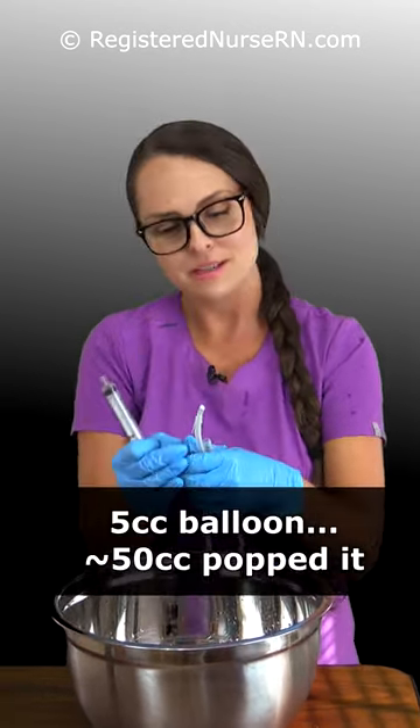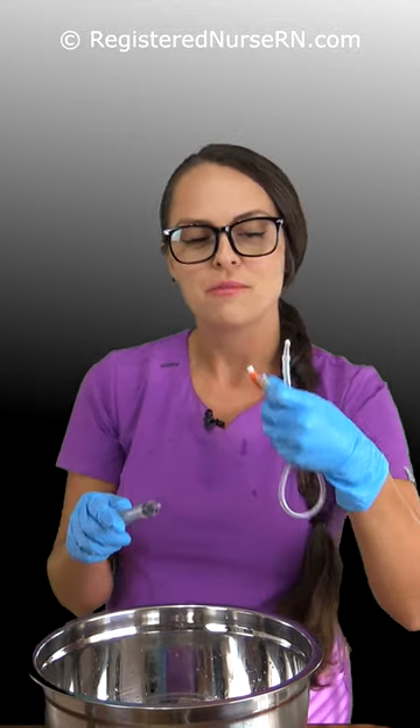So, 5cc balloon — 50cc is what popped it. If you ever have orders to flush the Foley, make sure you're using the right port, because you don't want to bust this thing inside your patient's bladder.